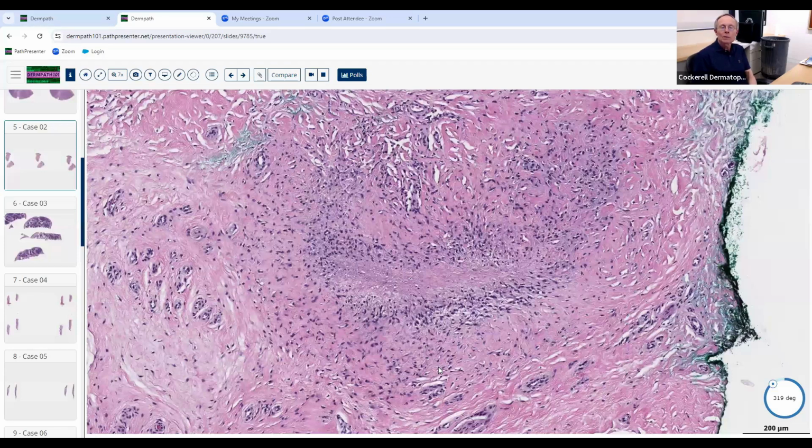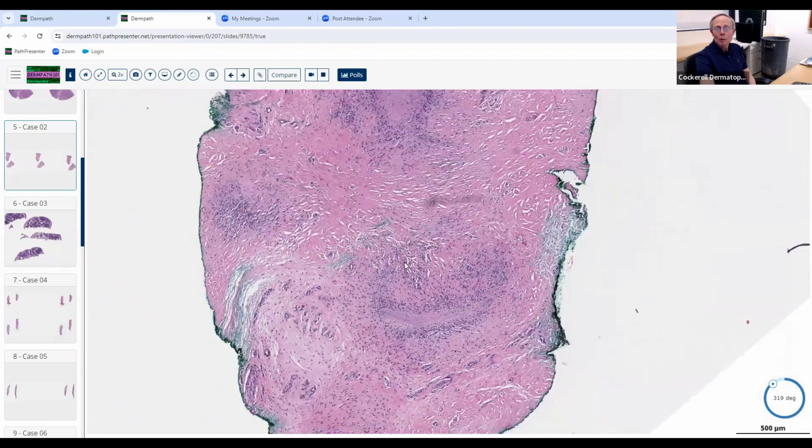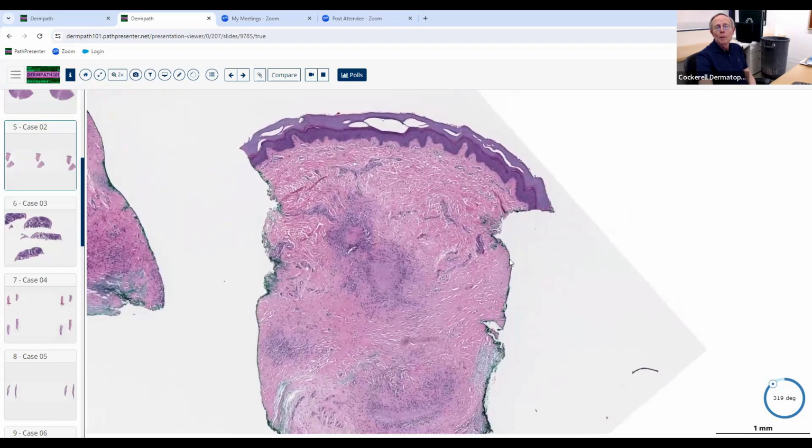We'll often see a case of rheumatoid nodule where you may get some mucin in the center of the palisade. We may see a little bit of mucin, maybe a little bit of fibrin, in necrobiosis lipoidica. So there are a couple of other things that can help you distinguish among the three. Necrobiosis lipoidica tends to have the so-called layer cake pattern of inflammatory infiltrate. So you see histiocytes and then degenerated collagen, and another layer of histiocytes and degenerated collagen.